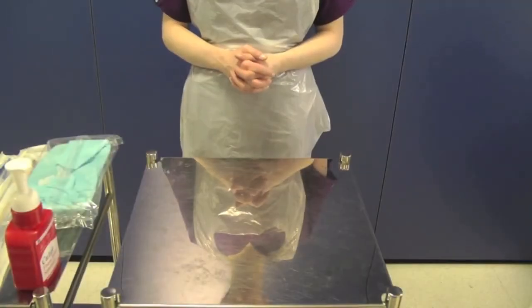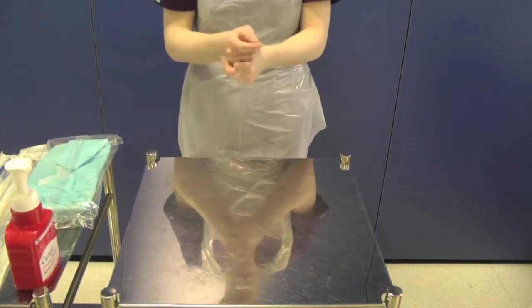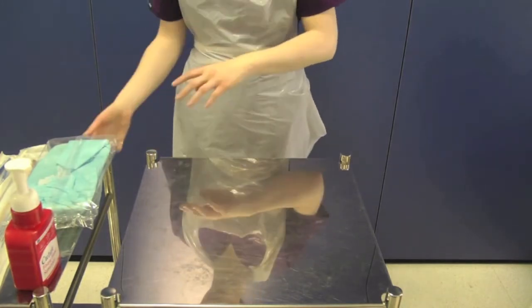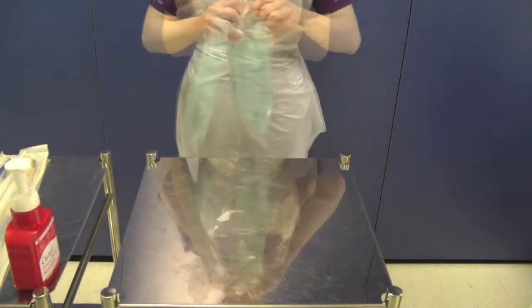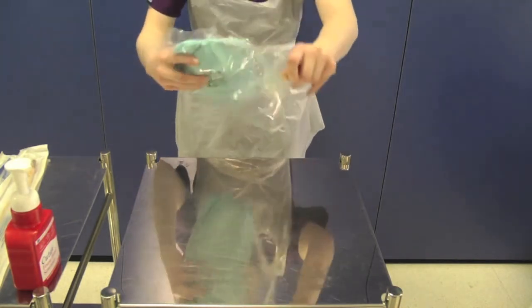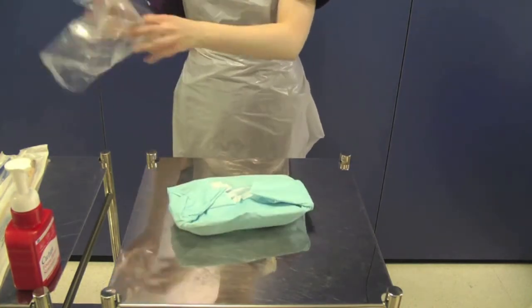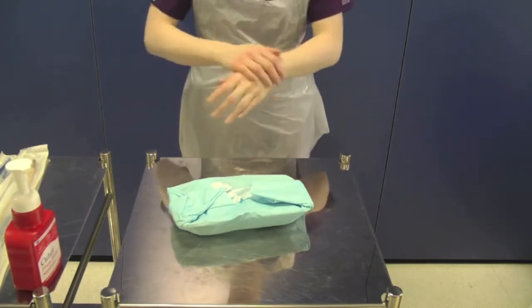Once you have cleaned your trolley, don an apron and decontaminate your hands using the WHO 7-stage hand washing technique. This must be used every time you decontaminate your hands. Take your catheter pack and check that it is in date. Open the pack onto the trolley without touching the contents. You must decontaminate your hands as you have been touching outer packaging.